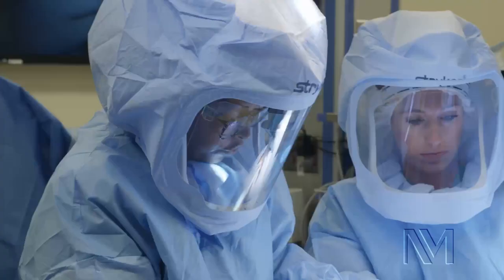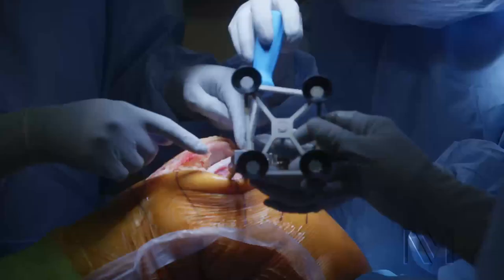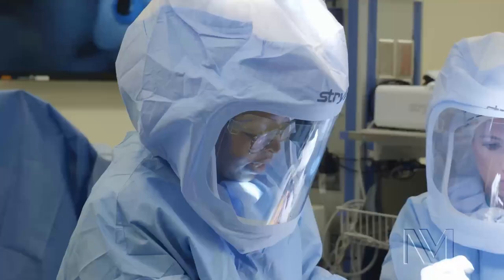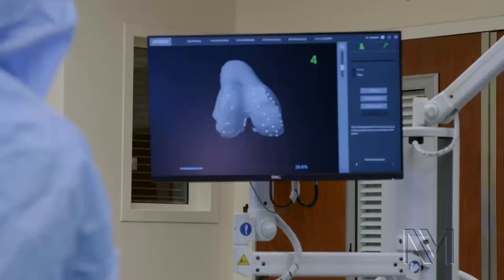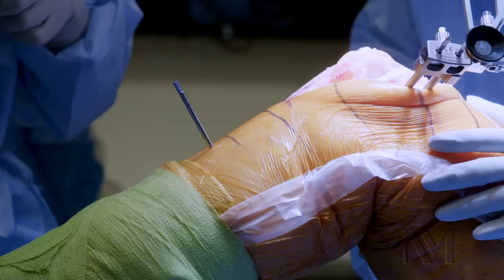The first part of the surgery is putting the pins into the femur to give us information about what the femur bone is doing. This sensor is a tracker that faces this camera, and these sensors give information to the robot back into the screen to give me information about what the knee is doing. In total, there are four pins for surgery — two on the femur, two on the tibia.